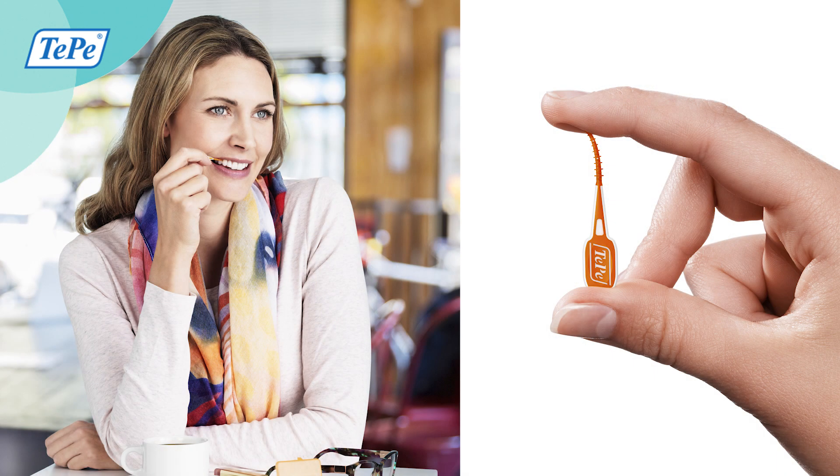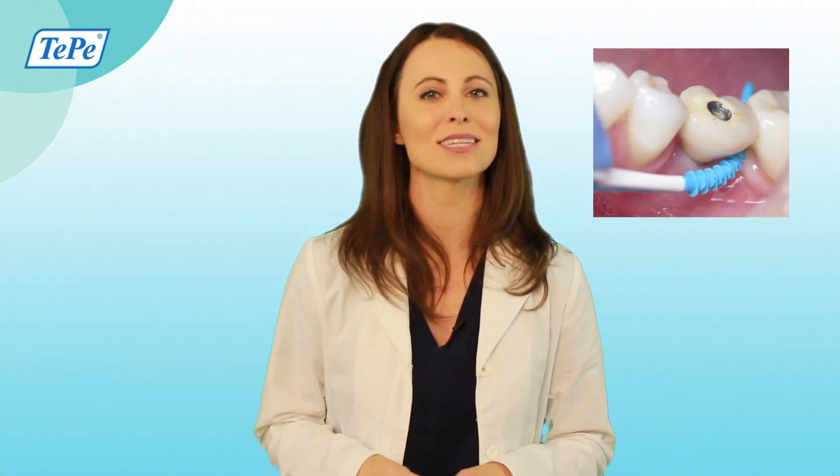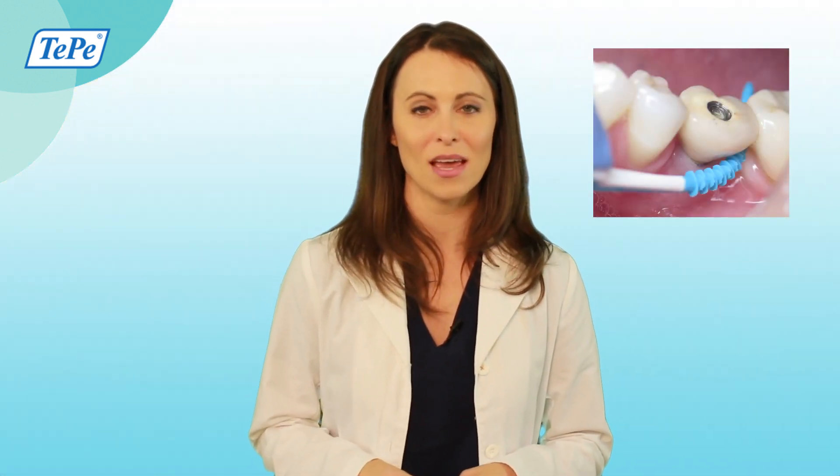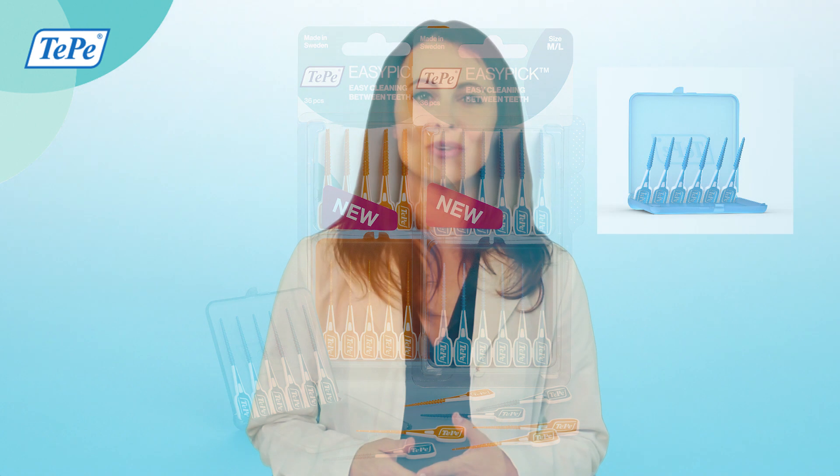The Easy Pick is flexible and durable, making it the perfect on-the-go option to clean and stimulate the gums between the teeth. It comes in two sizes — orange is smaller and blue is larger — and has a convenient travel case so you can take it with you everywhere this holiday season.